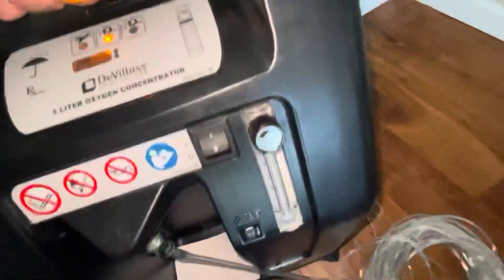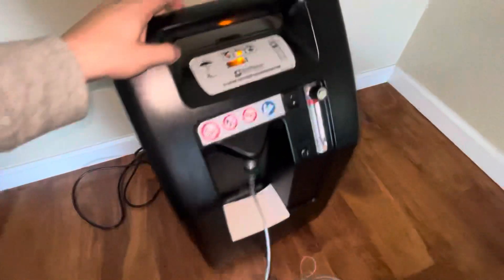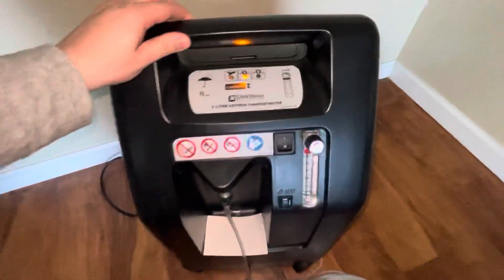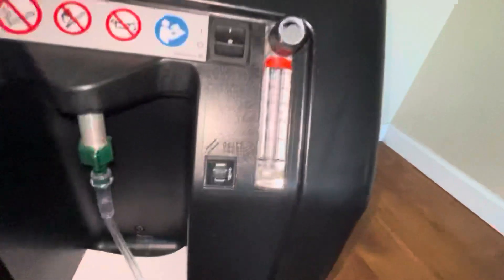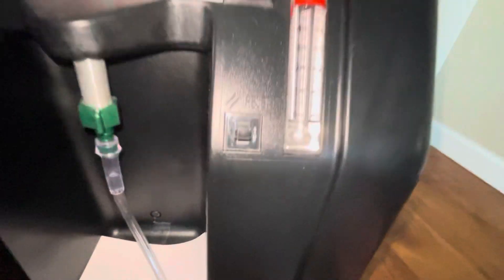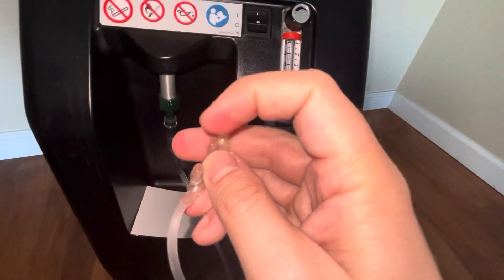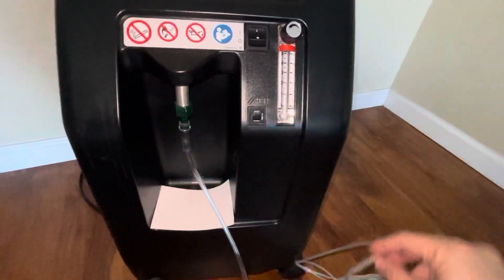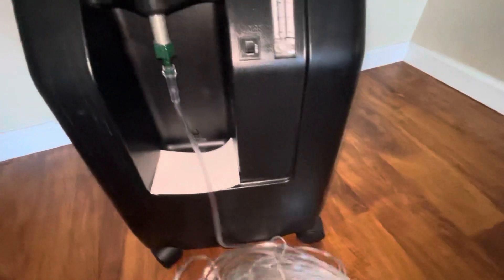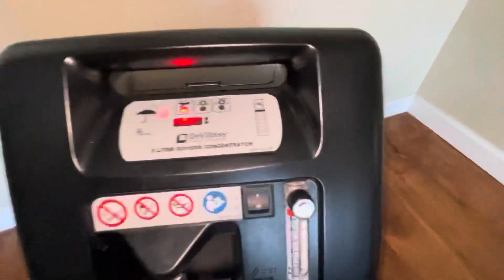Overall, you don't want to lift it — it's pretty heavy. Let it load up; it takes a while to circulate and turn green. The oxygen tubing connects at the bottom right. It's a pretty simple process. You should start feeling airflow through the tubing, but make sure the indicator is green before applying it to the person.